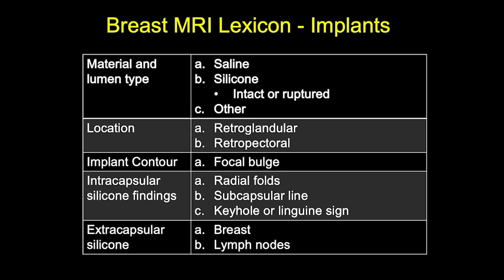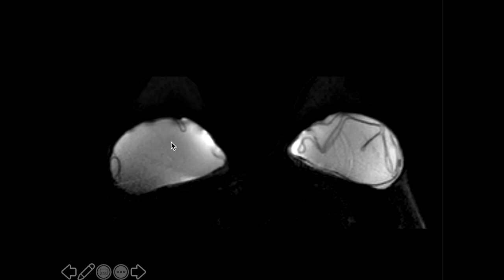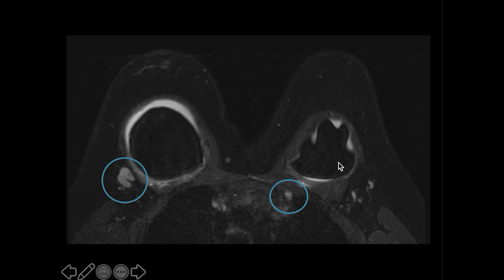Breast MRI is the best modality to evaluate for silicone implant complications, including both intracapsular and extracapsular rupture. On a silicone-specific sequence where silicone appears bright, the capsule lines are visible, and high signal intensity on both inside and outside of these lines indicates intracapsular rupture. On the left, more severe intracapsular rupture is present with the implant collapsed. Secondary signs of extracapsular rupture include enlarged axillary and internal mammary lymph nodes due to silicone within these nodes.